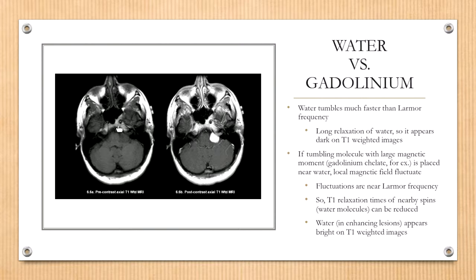Notice how right in here where the sella turcica is, there's a little bit of fluid signal in the T1, not too much. It's more of a fatty signal. But on the T1 post, we can see a whole lot more fluid showing up. Same with the eye socket. We can see a lot more of the viscous fluid as opposed to just the fat around the eyeballs. But also, there is this super bright contrast of yet another fluid area right here.